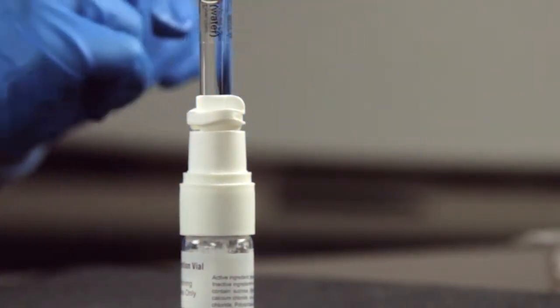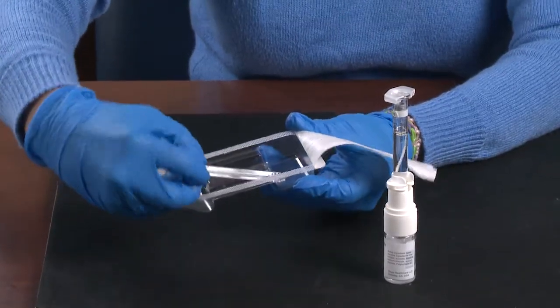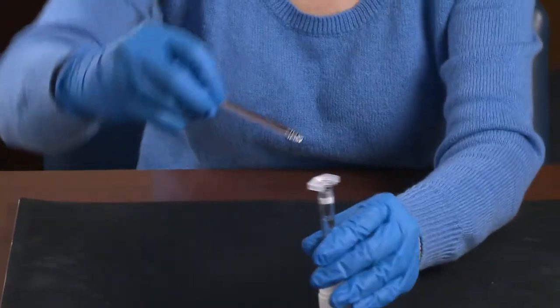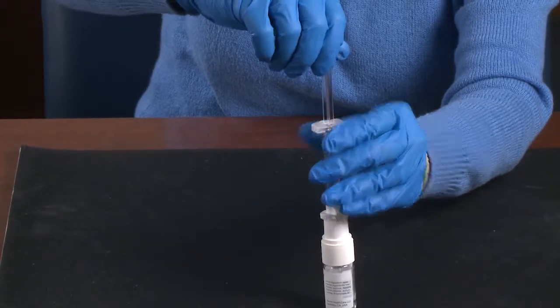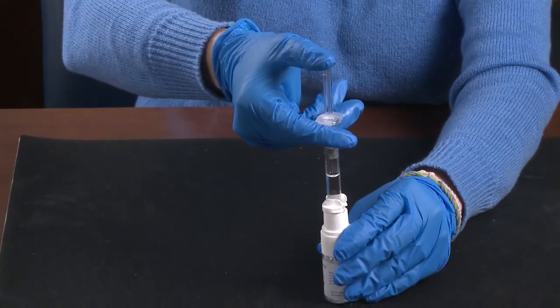It is okay to push the syringe down further if necessary. Next, pick up the plunger rod by the top. Do not touch the rest of the rod. Connect the plunger to the syringe by screwing it clockwise. Then press down slowly to push diluent into the vial.